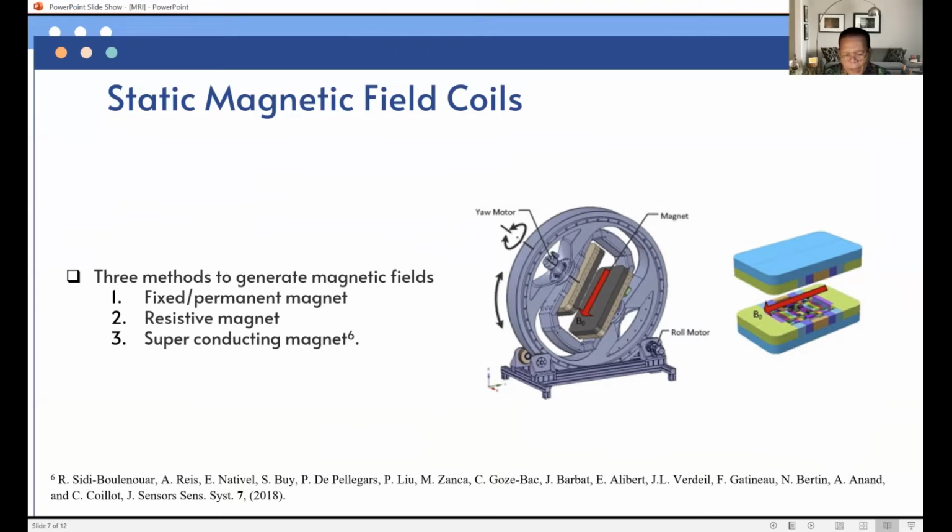Permanent MRI magnets use permanently magnetic iron, like a bar magnet that has been twisted into a C shape where the two poles are close together and parallel. In the space between the poles, the magnetic field is uniform enough for imaging. Up to 30 tons of iron may be needed, restricting their placement to rooms with a strong enough floor.